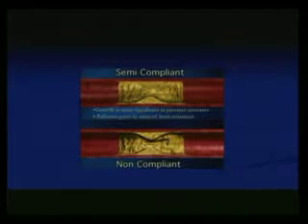A little bit about semi-compliant and non-compliant balloons. Semi-compliant balloon growth is more significant as the pressure increases. There's more growth. Grows in areas of least resistance. And so what compliance is? Compliance is the ability of a balloon to grow with the pressure. So semi-compliant, it grows more with pressure. Non-compliant usually does not grow as much as a semi-compliant balloon. More used for calcified, very resistant vessels.